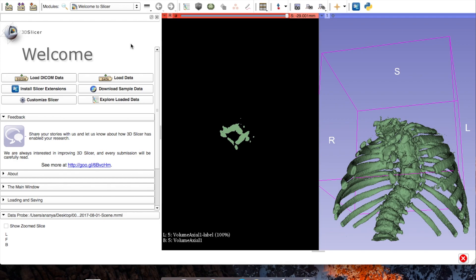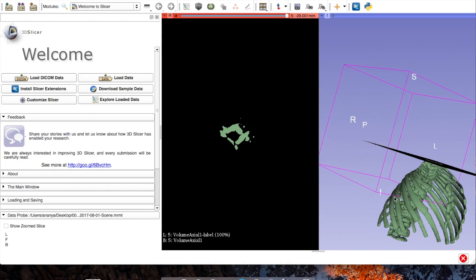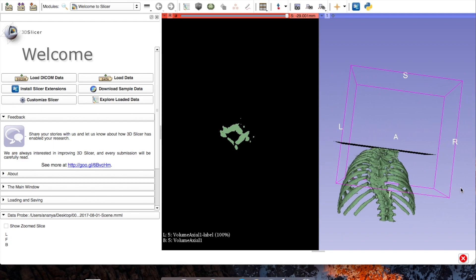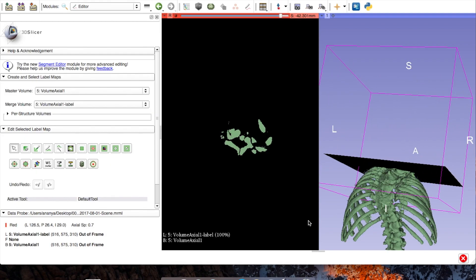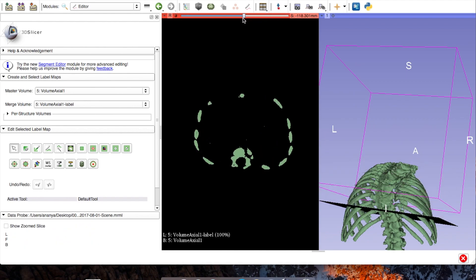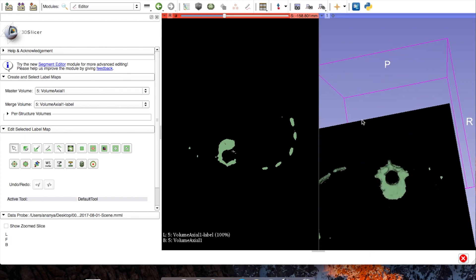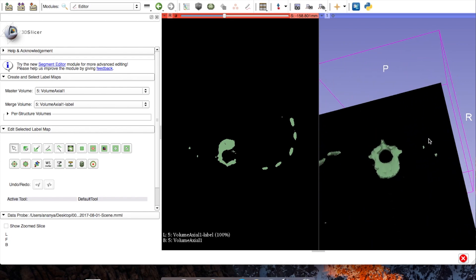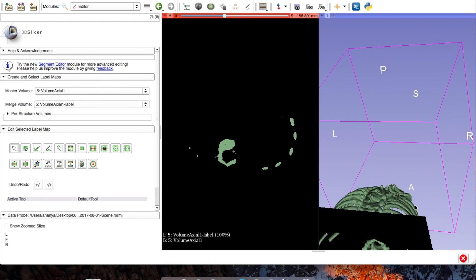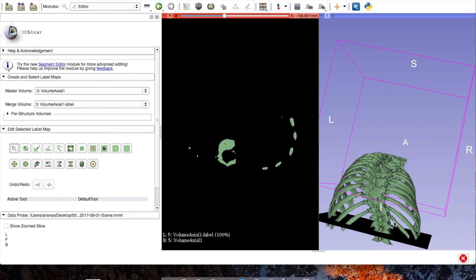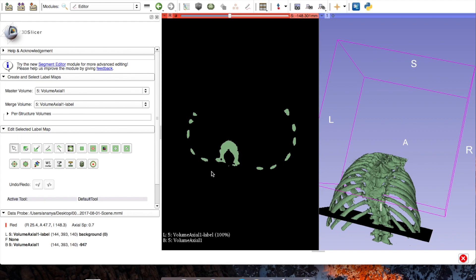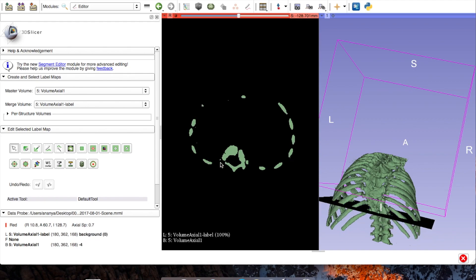Now we're going to isolate a single rib — you'll make a copy of the scan file for each rib. Go through the scan; you can start at rib T1 or T12. I like to start from the bottom — it's easier to see. Left or right side doesn't matter as long as you clearly label it. You can see the ribs starting to appear on the right and left sides, forming a sideways arc. Track one rib, identify where it ends and begins, then delete everything above it and everything below it using the Editor tool with an increased eraser size.